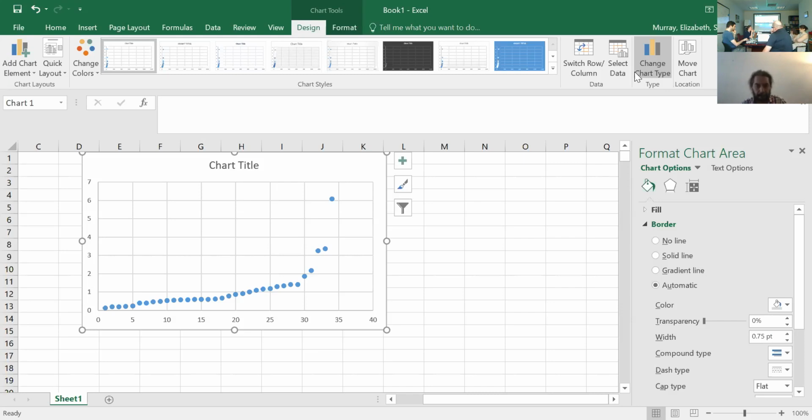Every person besides that one that I excluded in these motion ones had over 50 valid scans. So I can look and see how much variability there is in how many, broken down by group. So the idea is to find what best splits the two groups and include that as a second level covariate. Not necessarily splitting the two groups, but whichever thing explains most of the actual variability in some general notion of activation, like an average activation across the entire speech network, or something that you expect to be a relatively strong effect, like a speech minus baseline effect on average across all of the speech areas. If it's a strong effect, you expect a high average across all subjects and low variability across all subjects. So whatever explains that variability is going to help you increase the sensitivity to that average effect.